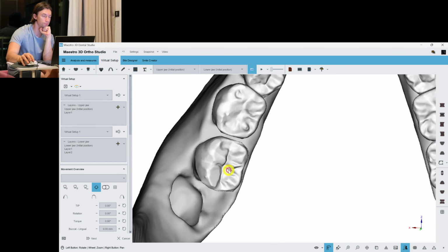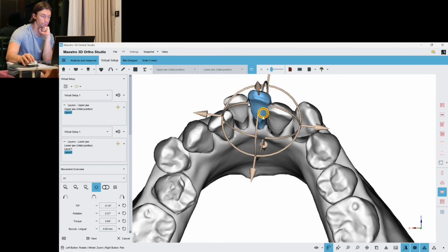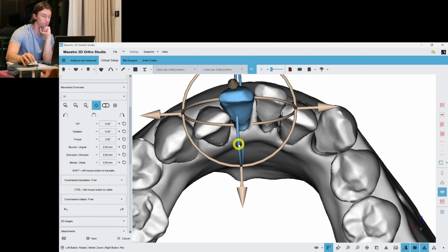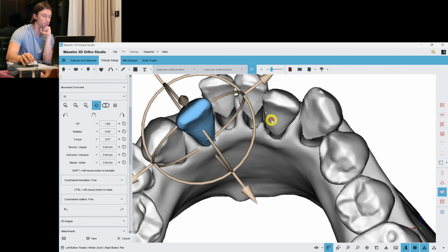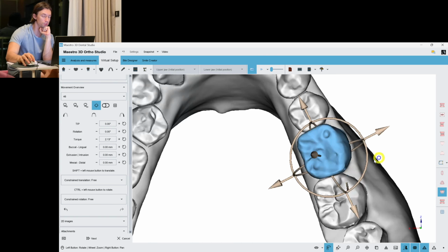Layer 2. So here we move the second molar to the final position. Let it be minus 10 degrees. And start to move the first molar for the second half. And expand a little bit. Proclining the incisors more. Buccal tipping for the right side.